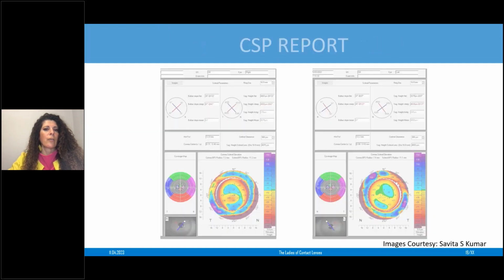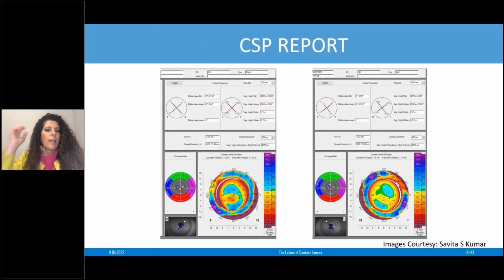Okay, here you can see that the corneal topography is a moderate keratoconus, and also the sclera in this case is not special. He has a normal toricity, but again, the patient wanted customized scleral lenses, so why not provide him with what he's asking for?